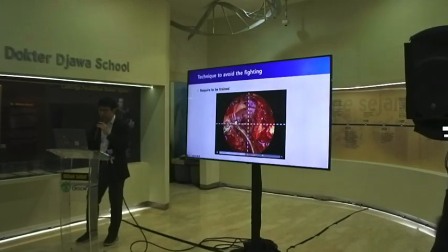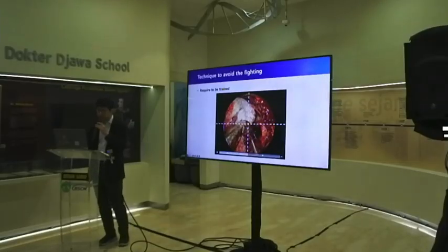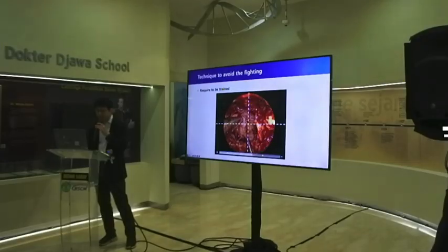Always keep some space in the center of the endoscopic view. It's a dissection from the superior hypophyseal artery, and always keep some surgical field space.